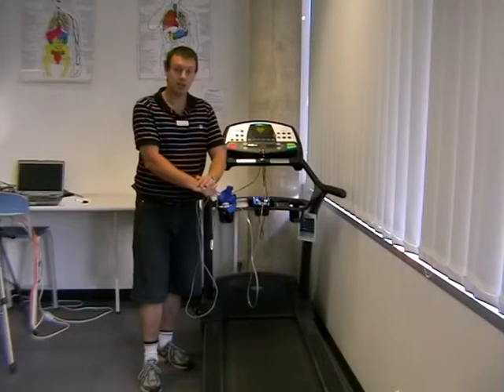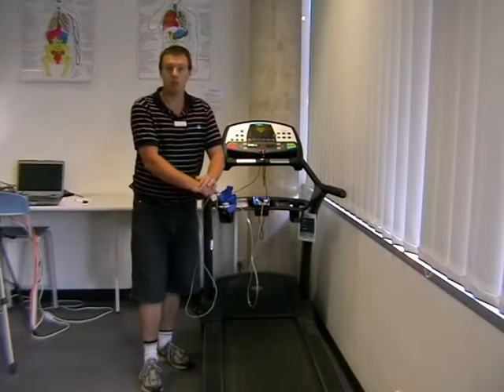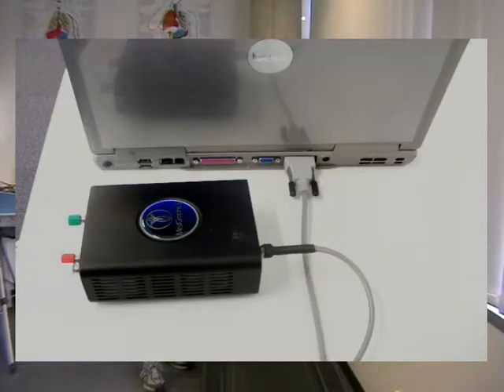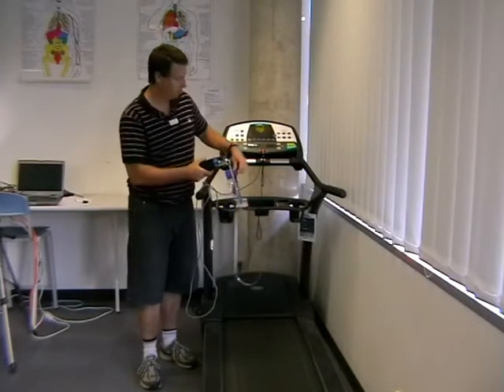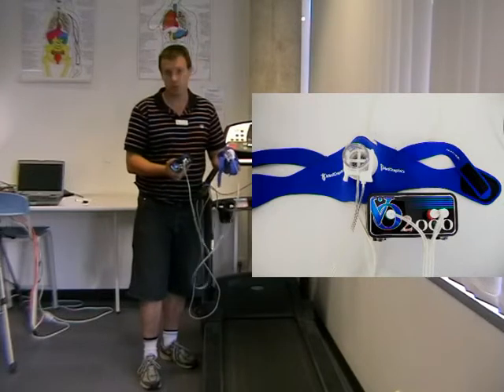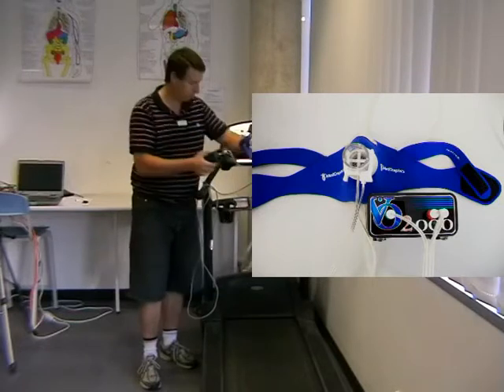The gas analysis system we use here at the ASMS is one of a number of ones which have the very special capability of being downloadable. Now that enables a subject, they're not going to be doing it here because they're on the treadmill, but to actually take the unit and, wearing a very special kit that transfers with some battery packs, they're able to go out into the field using this mouthpiece and to collect data. When they come back to the laboratory, that data is then able to be downloaded into the laptop for subsequent analysis. Now, as I say, we're using the treadmill here, so that's not going to be particularly relevant to us.